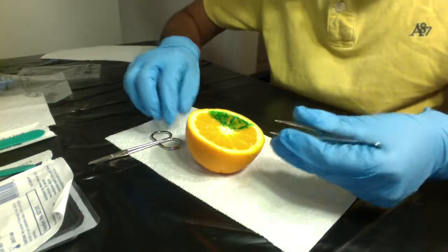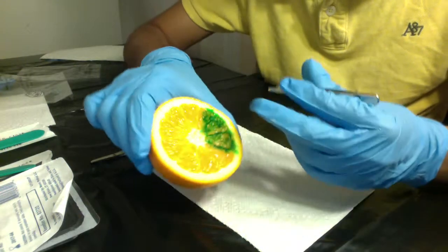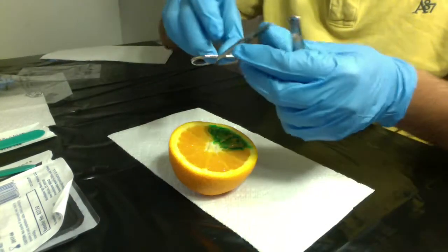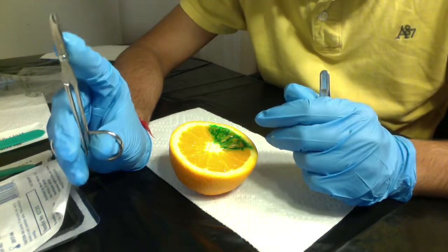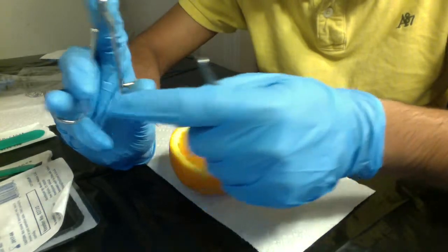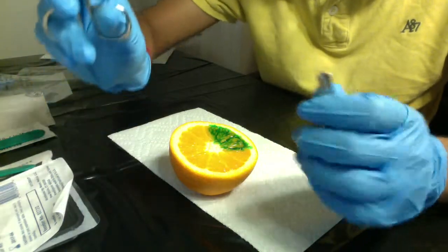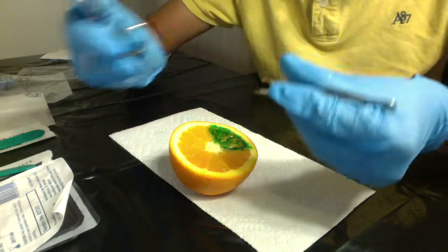I'll be using 2 techniques. So this is my orange, and I'll be using the mid portion of the orange. The grip of the scissors is a 3-point grip, using the finger on the shaft, and the ring finger and the thumb are the other 2 spots of contact. Scalpel grip.